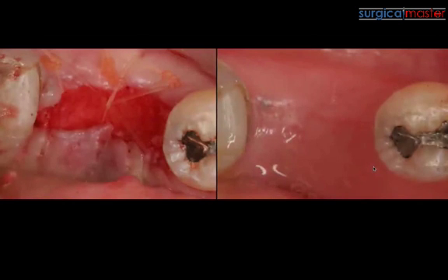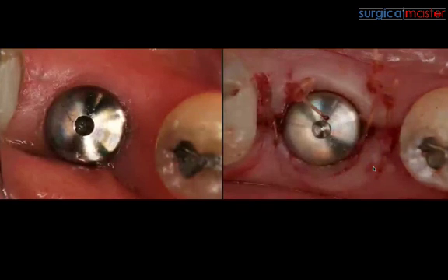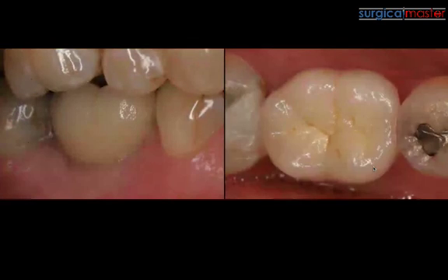Place an X suture — you don't have to aim for primary closure at all. This is one of the major misconceptions: many doctors think they need to advance tissue to primarily close the socket for better healing, but quite the opposite is true. Doing so compromises the soft tissue and blood supply. The compartment extraction technique intentionally leaves the occlusal part open, resulting in more attached keratinized tissue, better bone quality for your osteotomy and implant, and good soft tissue around the final outcome.